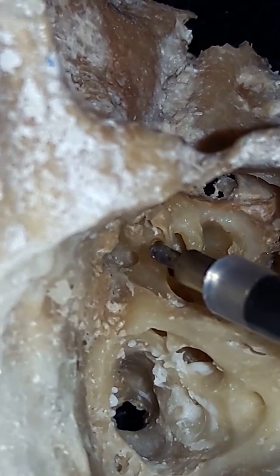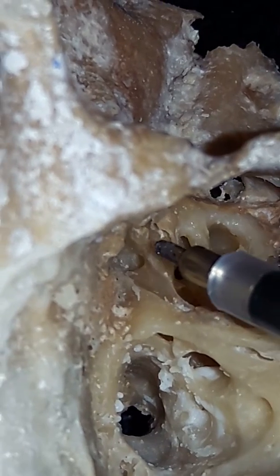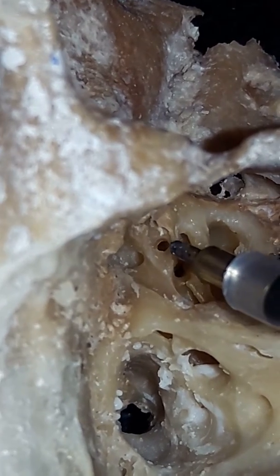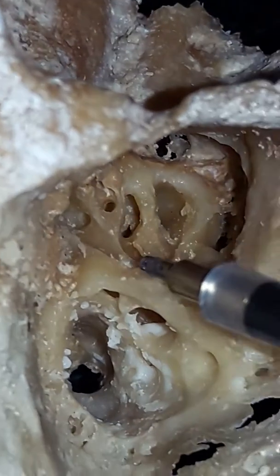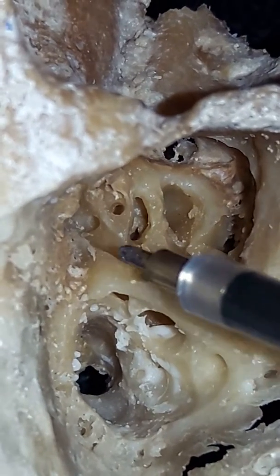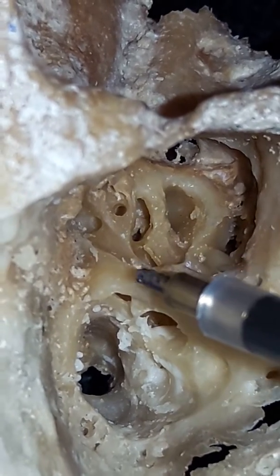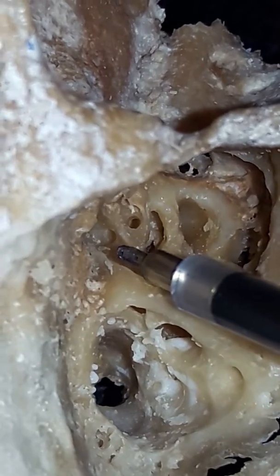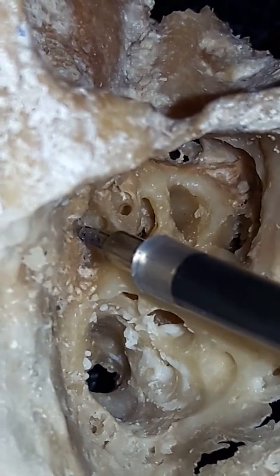And next, how to identify the superior turn cochleostomy. The superior turn cochleostomy is present in the groove of the tensor tympani, here just above the processus cochleariformis. Here the facial nerve is, this is almost very long preserved bone, so we lost the facial nerve in the preservation itself. This is the oval window, just above that is the second genu. This is the horizontal part of the facial nerve, and it turns backwards, that becomes the labyrinthine part of the facial nerve.